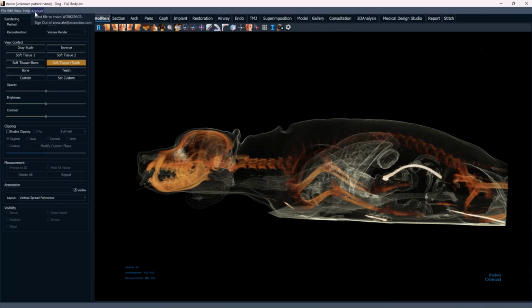As long as we've got it installed, we can essentially sign in there within a concurrent limit of what we have available. And when we're finished with our session, we can simply click this account drop down. And then as you see there, go ahead and sign out to release or end access to the software suite. Now, it's not necessary for you to do that all the time. You can most certainly leave it signed in as well, and it will go ahead and maintain itself. But if you'd like a little bit more flexibility in moving around to your installed desktop applications, you can use this function to sign in and sign out as needed.